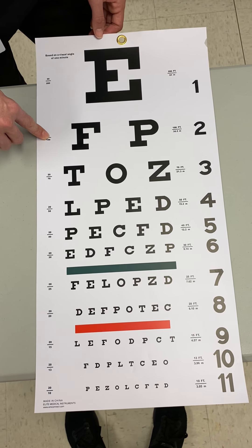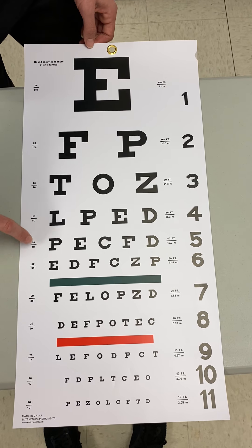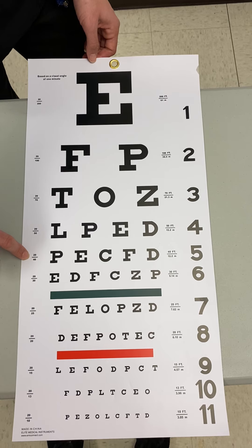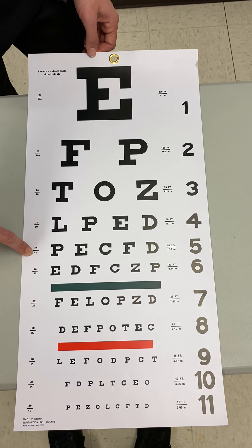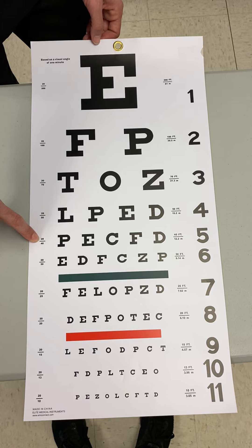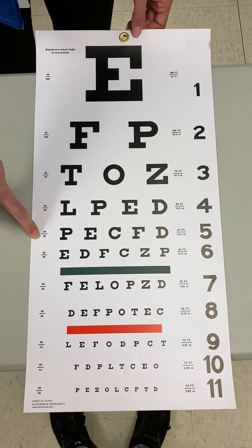These numbers next to the lines on the left are used to judge the patient's vision. For example, if a patient scored on line five and their vision was labeled 20/40, that means our patient is standing 20 feet away from the chart, and the average person would have been able to read that same line at 40 feet away — 20 feet further back than our patient. The top number always represents the distance they're standing, which for the Snellen is 20 feet, and the bottom number represents what distance the average person would need.